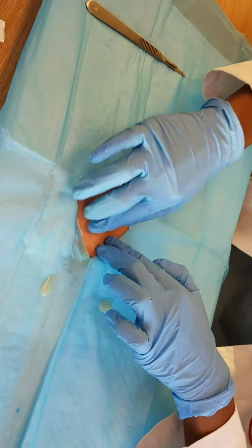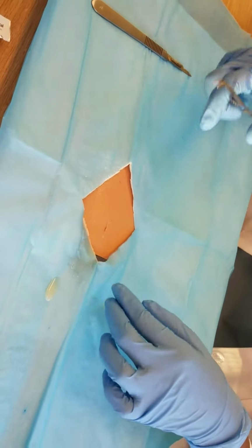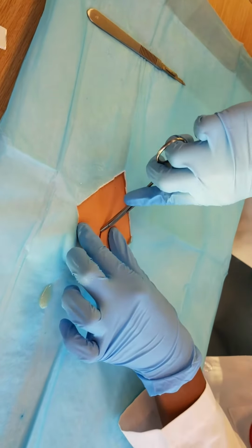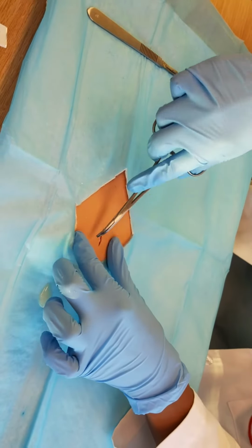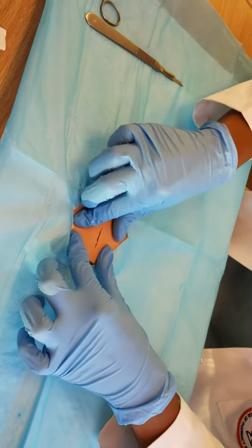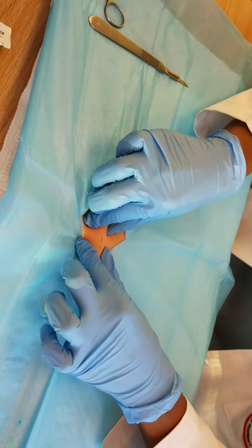And then you want to get your hemostats, and you want to make sure that you break up all the material that's in here. And then see if any more comes out. Oh, there's a little bit.